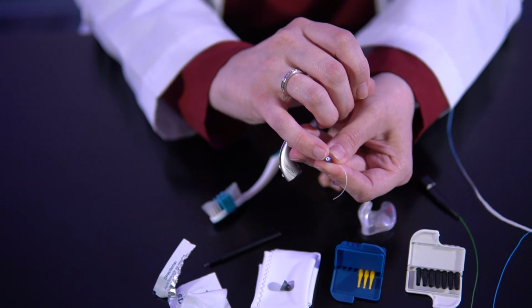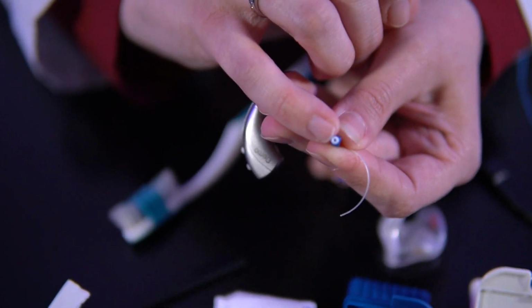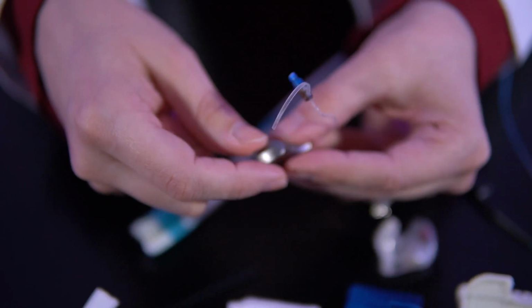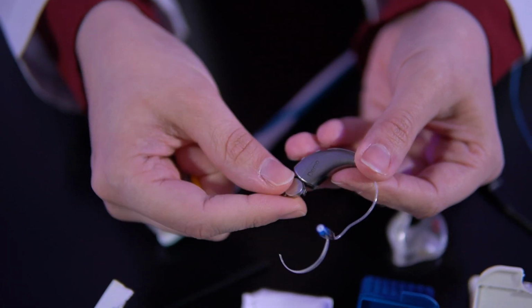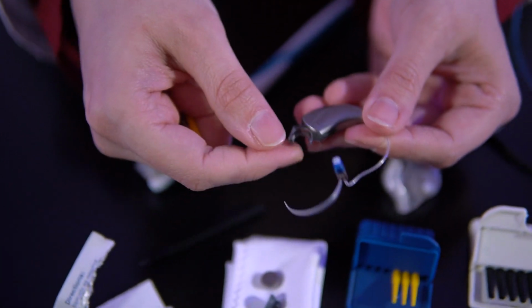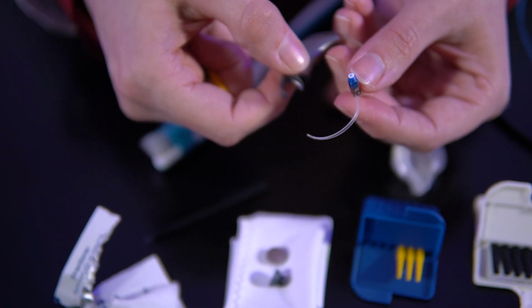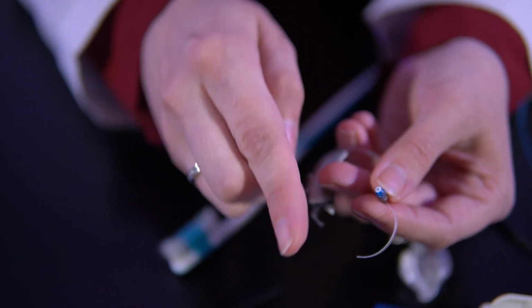This is the number one reason I tend to find why all of a sudden someone can't hear and they come into us saying their hearing aid is dead. So like I told you earlier, some people will open their battery doors, take their battery out, and they'll replace it 20 times and say my batteries aren't working, when in reality, it's just this part, okay?